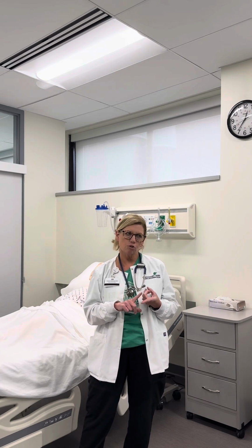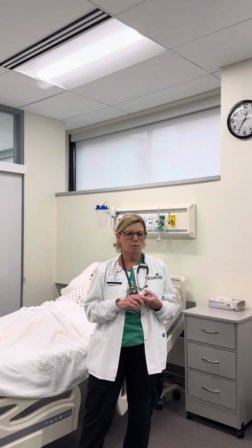The patient has active bowel sounds in all 4 quadrants, and then I gave them their medication through their G-tube. They tolerated that well. I want to also document about the residual, how much the residual was. They had 20 milliliters of residual yellow fluid, and the pH was 2, so good placement. And that's it.